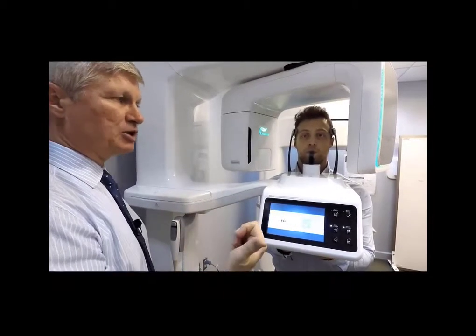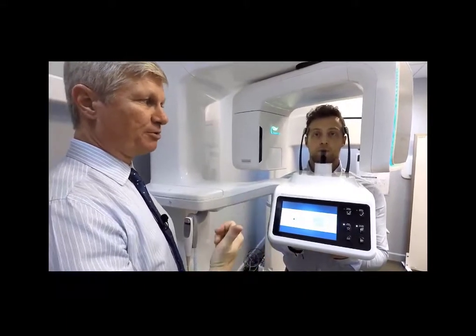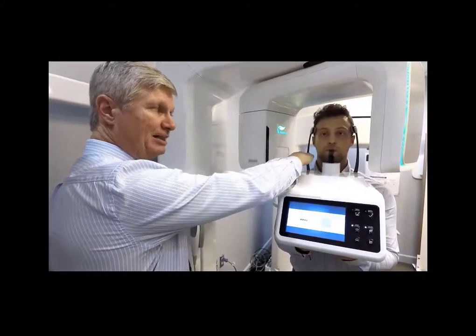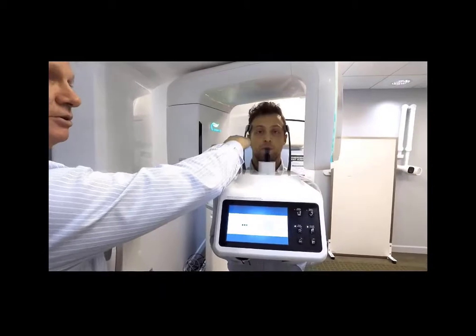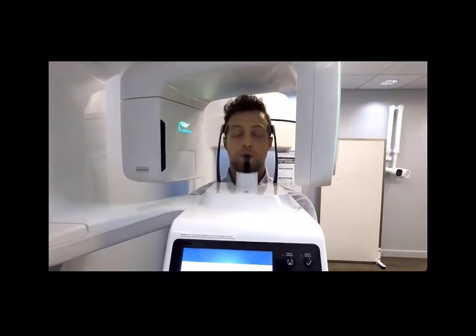So just prior to image capture, we're going to then provide the following instructions for a patient, specifically for our 3D. Go ahead and swallow. For 3D, the tongue can stay flat in the patient's mouth. Only for 2D, it needs to be at the roof of the mouth. Tongue stays flat. Breathe slowly through your nose. Close your eyes and stay still. And that's it. Now ready to capture image itself.